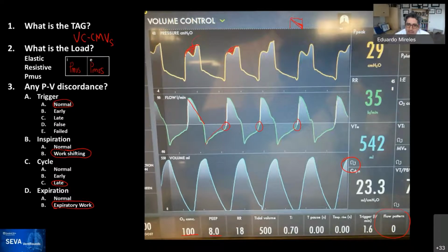And so sometimes in patients like this, if you really want to know the physiology and it's important for the management of them, doing things like giving them a bolus of propofol or sedatives, or even a dose of paralytics in some of them, to be able to read them. But I've been caught misreading this as increased resistance, only for it to disappear the moment that you sedate the patient. And that goes with what Dr. Douglas is mentioning of putting the hand on the patient and seeing the active exhalation.